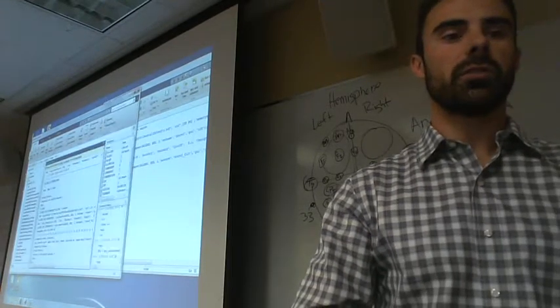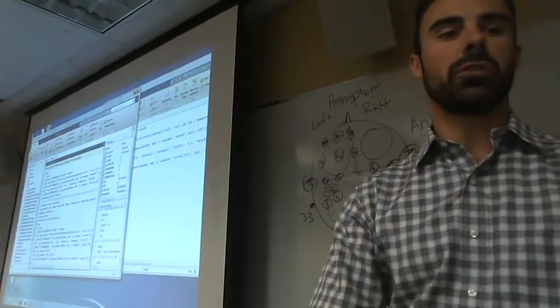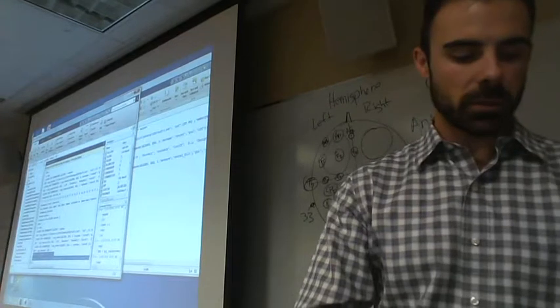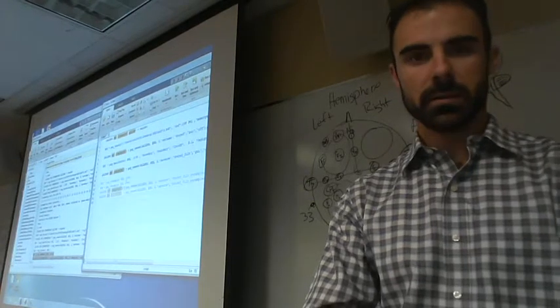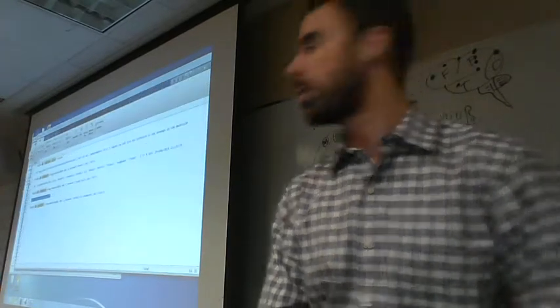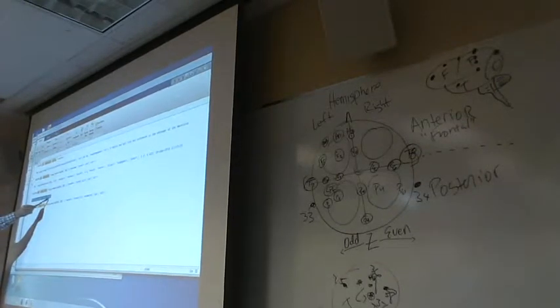Okay, so let's do EEGH again, and let's find out what the code looked like for that. We take our bottom 2 lines, copy, paste. So this is our command right here. This is our command that says resample the EEG to 256 hertz.